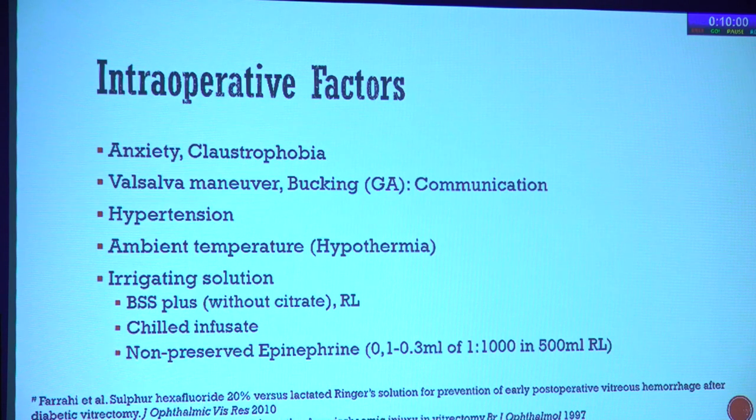And if there is a high risk of bleeding that you are expecting, in that case you probably should not use the regular BSS. Use BSS Plus without citrate or the Ringer's lactate. I am very fond of using chilled infusion bottles. So I keep the bottle in the fridge for at least 8 hours, usually the previous night. And I do these cases first case of the day.